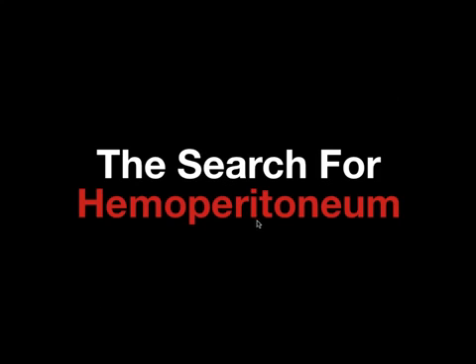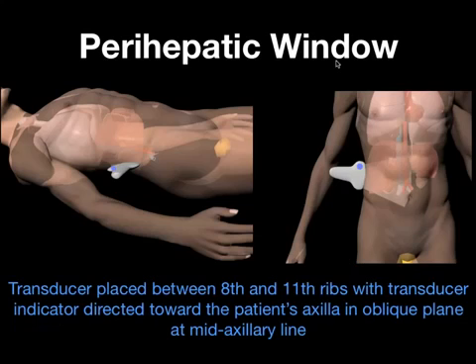Let's look now for hemoperitoneum. The perihepatic window is going to be your workhorse intra-abdominal window, because remember, we had already talked during the anatomic section that regardless of the source, free fluid will have a tendency to go to this right upper quadrant region. So this is one that you're going to want to become very familiar with in terms of performing and interpreting.